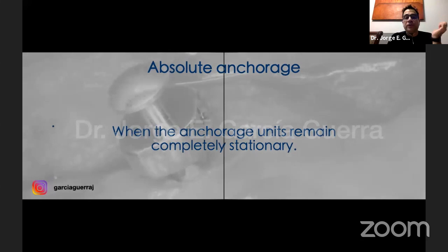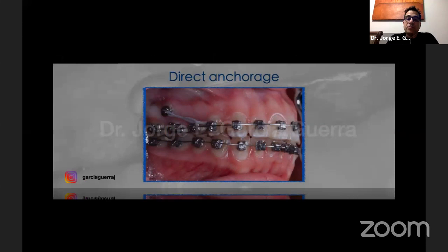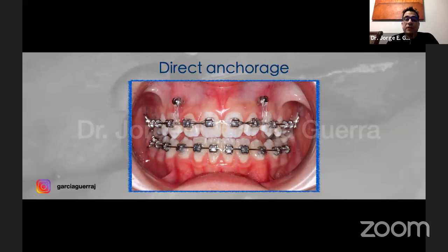Okay. Now, talking about clinical applications, we have direct anchorage and indirect anchorage. Direct anchorage is when we put the force directly from the mini screw or mini implant, to a notch, a hook or a bracket, like we see here in the picture. That's the direct anchorage situation. We can also use it like this. In this case, we're intruding the anterior segment of a patient. This is when we do it directly.